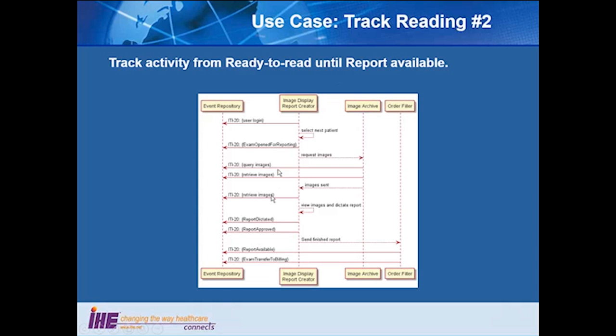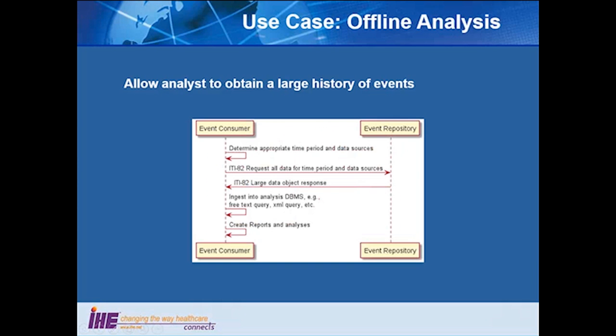And noted some of these here are existing logs out of ATNA for activities that are already being captured, and we are using ATNA. New stuff, fairly simple one. This one actually exists in ITI, so we just point at it and explain it. When you're doing analysis, you need a way to request, say, all of March. And there is an event repository transaction to do something like it, all of March.